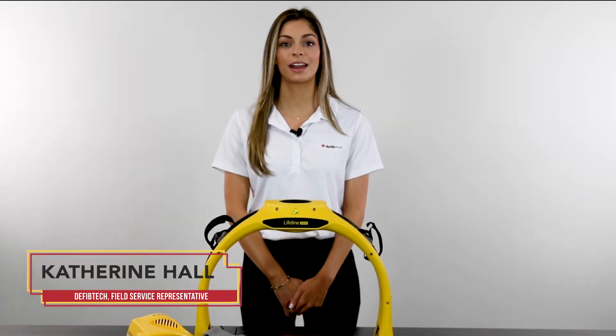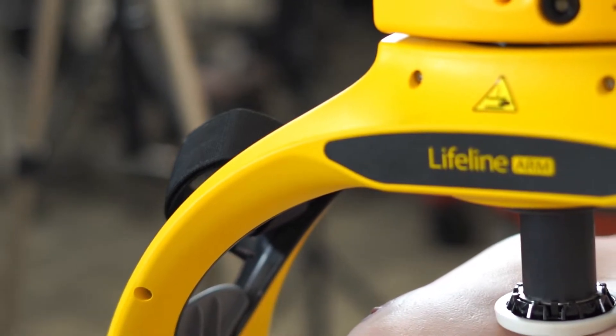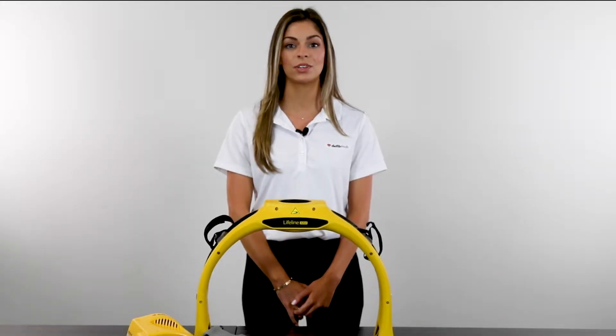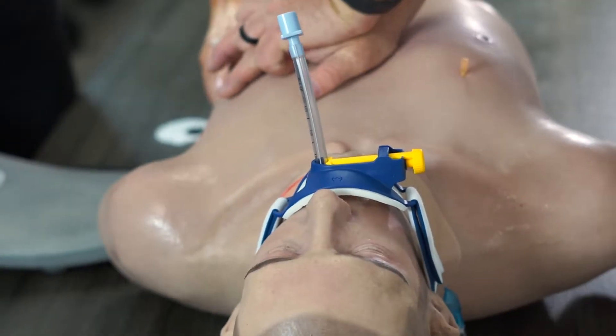Hi, I'm Katherine from DeFibTech, and I'm with Master Medical Equipment today to give you an in-depth look at the Lifeline Arm, DeFibTech's automated chest compression device. The Arm's efficiency and ease of use are designed to save time during rescues and provide top-of-the-line life-saving chest compressions.